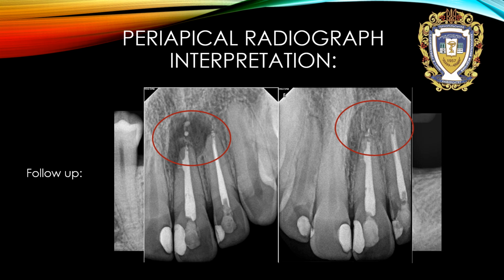As you can see, after successful endodontical treatment, we can observe restoration of bone.